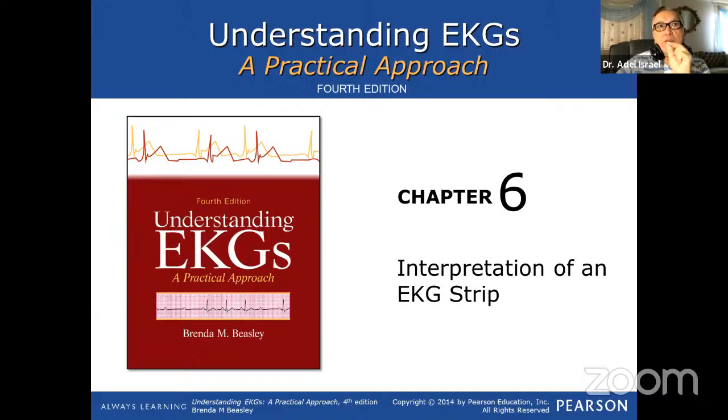What else do we need to know about the information we are going to use today? As I told you, it is very important to recognize the intervals. We have two important intervals. The first one is the PR interval, and this PR interval indicates the conduction time of the impulse from the SA node to the AV node, and according to this, it will make atrial contraction.